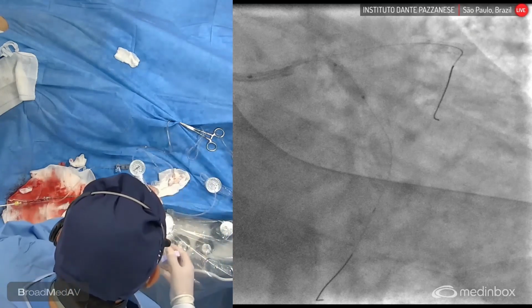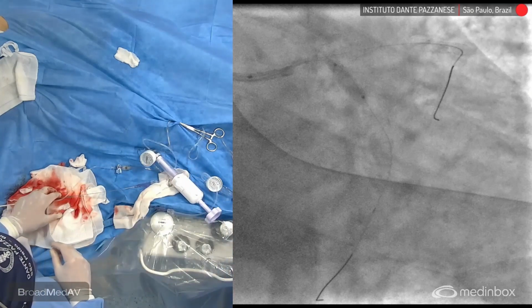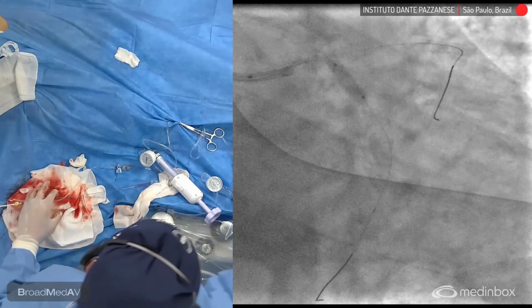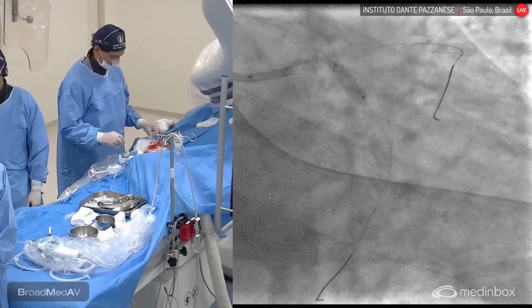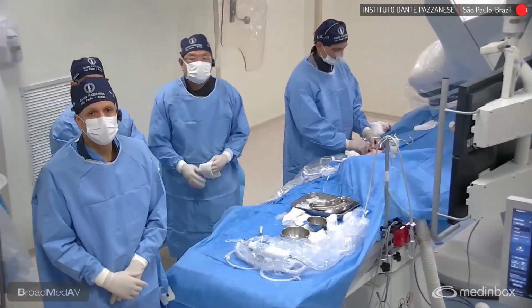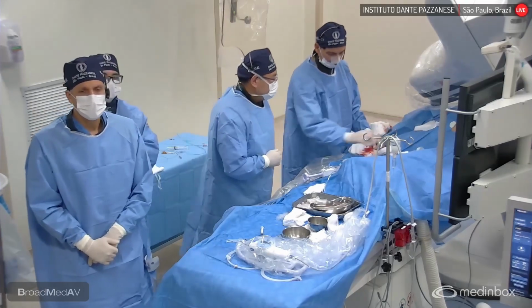And we're gonna keep here. So I think, can I have the camera here with me now? Please remove the angio. Can I have the camera here now? Okay, just have me here.